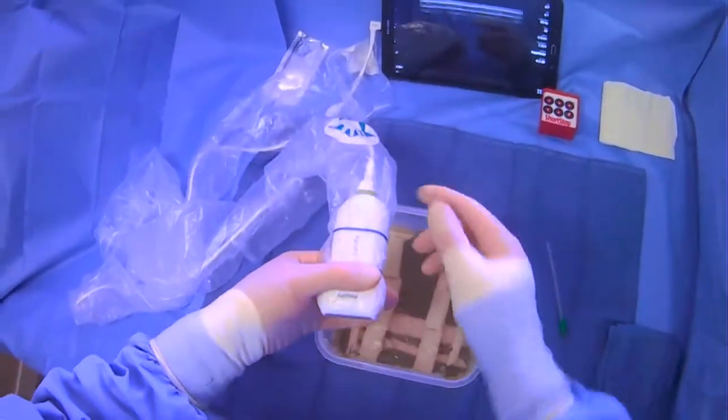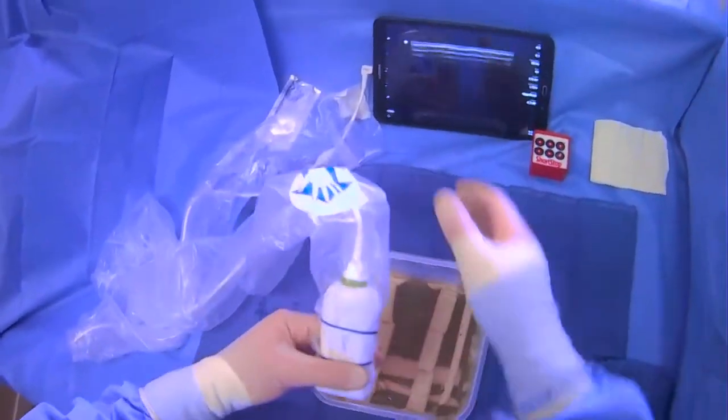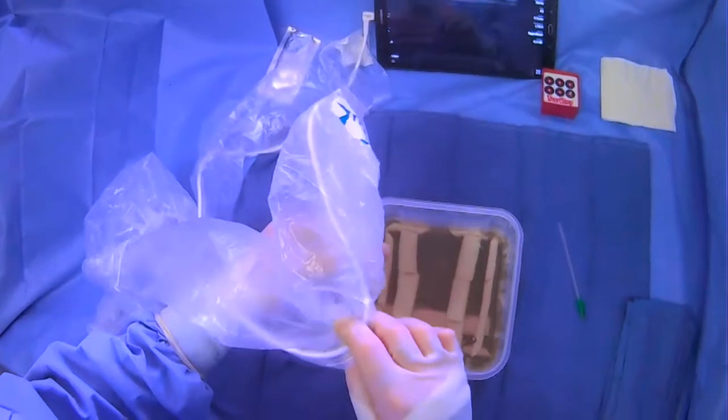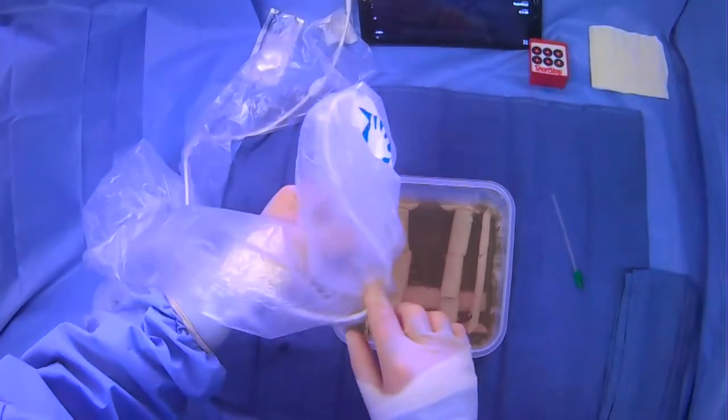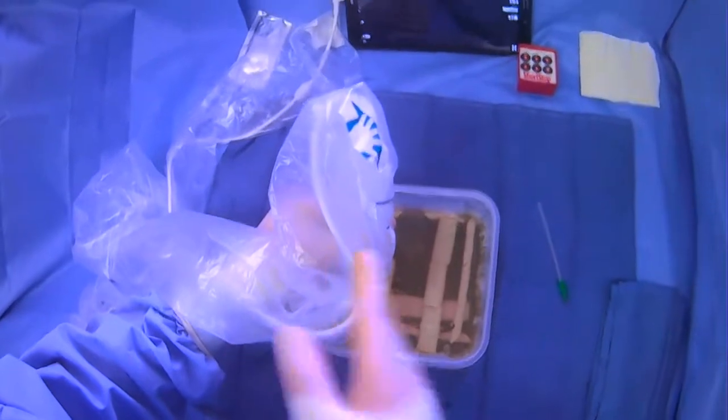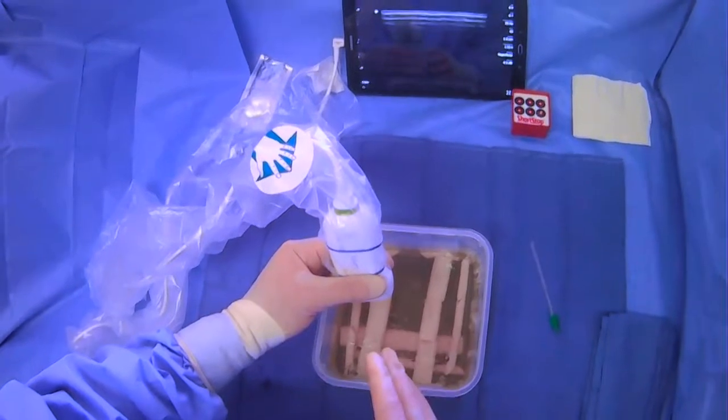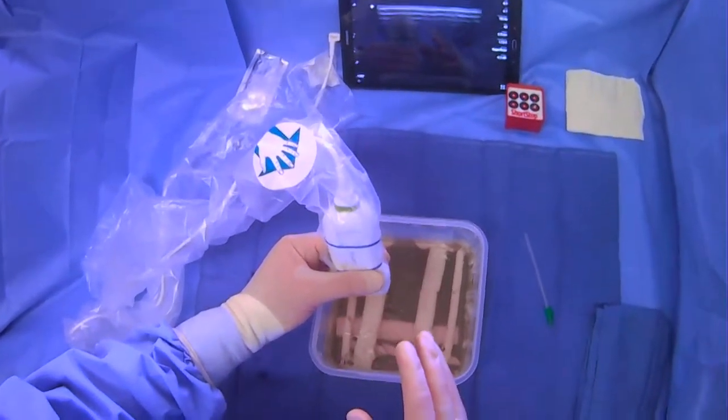The other is the cord. So the cord should never be in where you're working. If you're trying to gain access from this direction, you have to make sure that the cord is out of your procedural field. So that's very important.